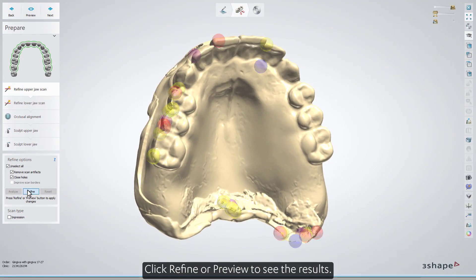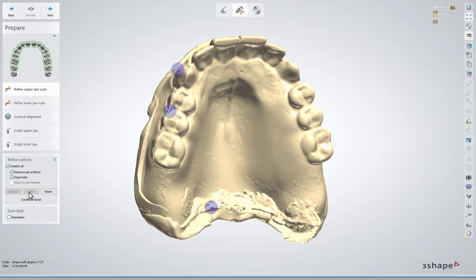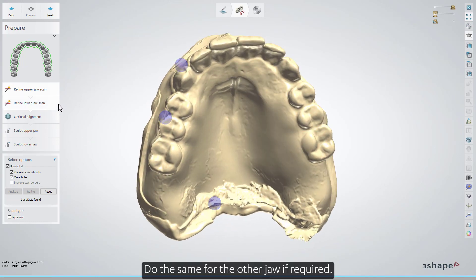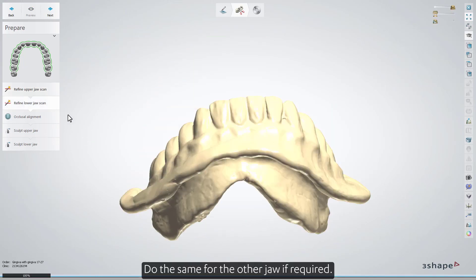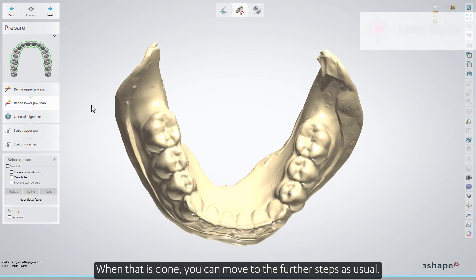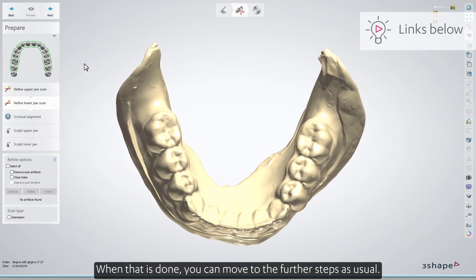Click Refine or Preview to see the results. You can use the Analyze button to check the scans again. Do the same for the other jaw if required. When that is done, you can move to the further steps as usual.